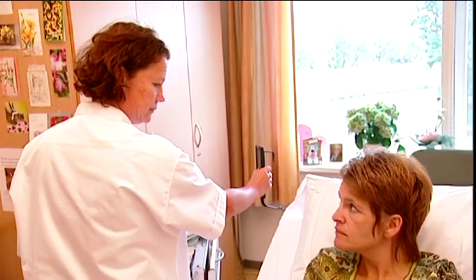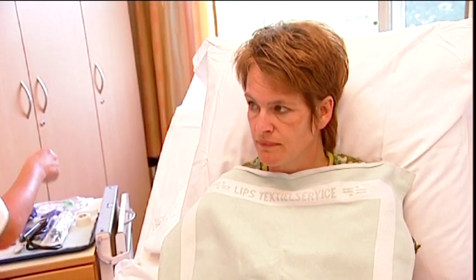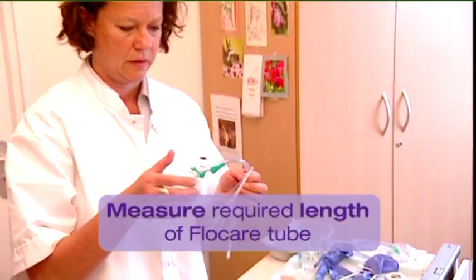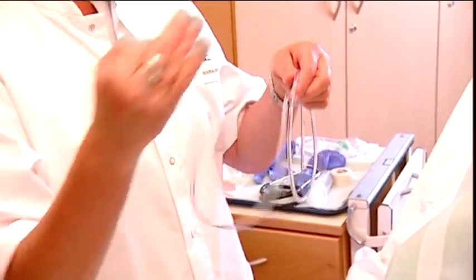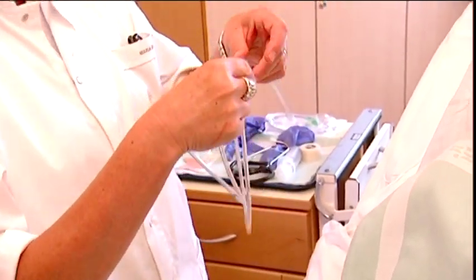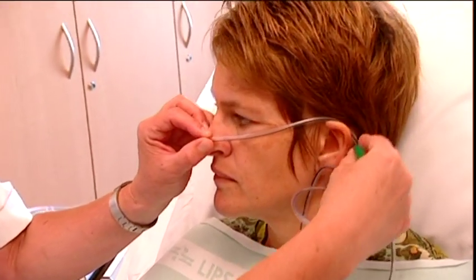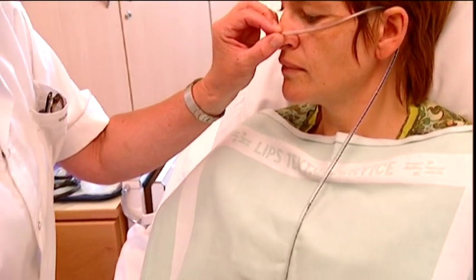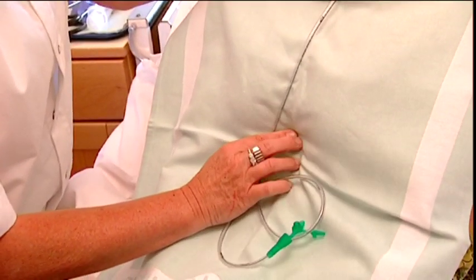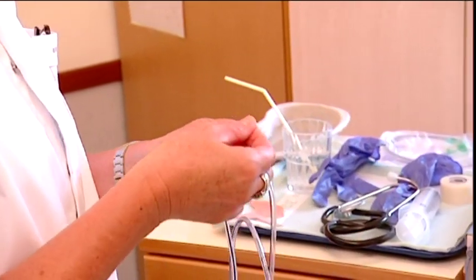Place the patient in a semi-recumbent position. Place a towel on the patient's chest. Measure the required length of the tube by keeping the tip of the tube at the lowest point of the sternum and leading the tube behind the ear to the tip of the nose. Mark the tube at this point with a pen or tape.